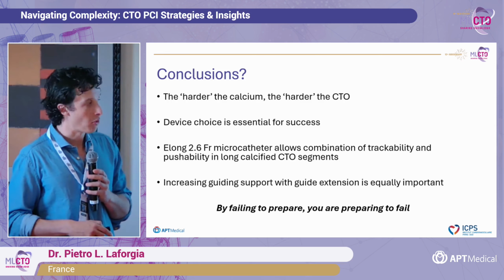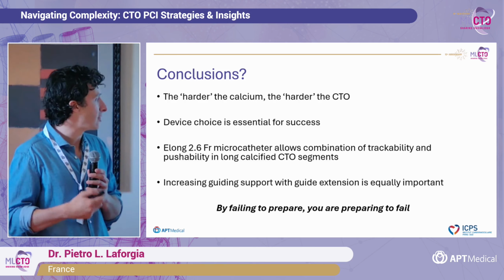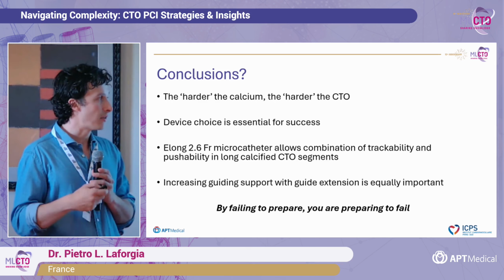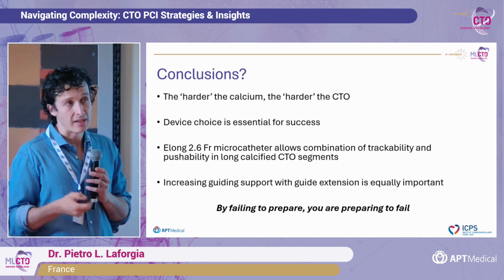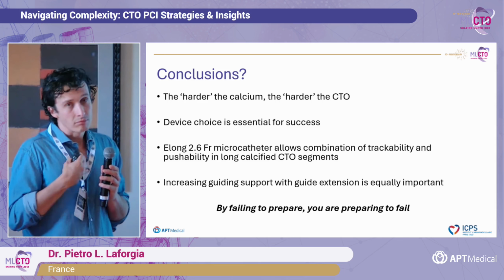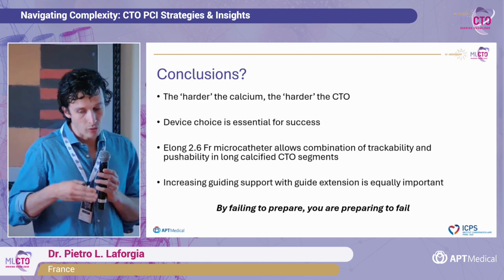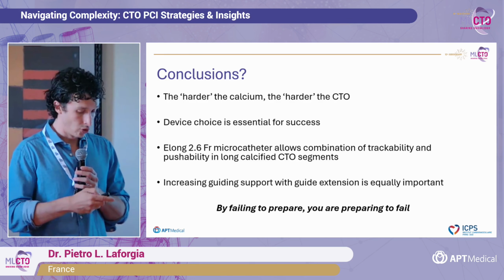Very, very good results. And the same thing applies when you need to think about guide support, which is of course essential, but the guide extension is very important. And when you're doing long cases with patients who might be suffering chest pain, ST changes, having the side holes is a really big advantage of this tool. And again, for younger operators like me, sticking to the same material is always a good choice.